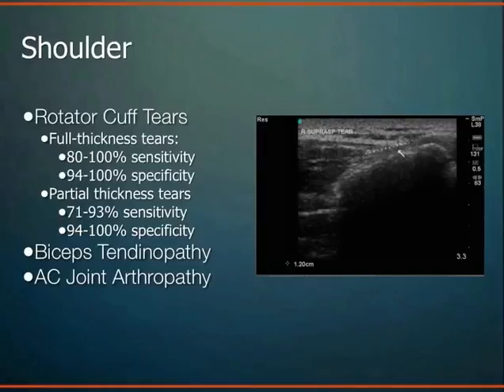So around the shoulder, this is an area that has been studied a lot because this is one area that is very common diagnosis and clinical complaint. Shoulder pain, shoulder impingement, rotator cuff tendonitis, a big reason why patients come into the clinic, and a big reason why we order a lot of MRIs. And so people are trying to find out, can we use ultrasound in the office, avoid MRIs, avoid healthcare costs, and is it a reliable modality to diagnose these rotator cuff tears or rotator cuff tendinopathies?